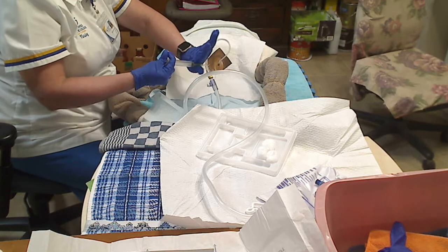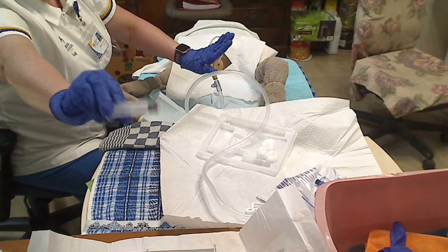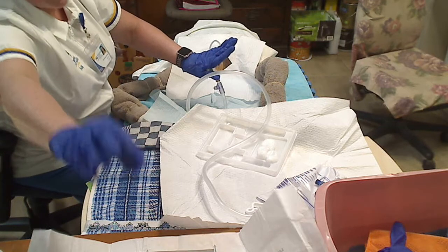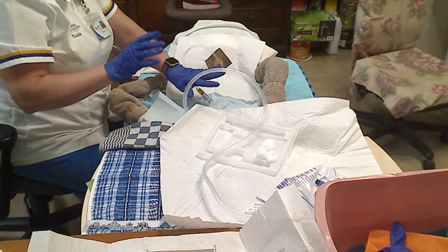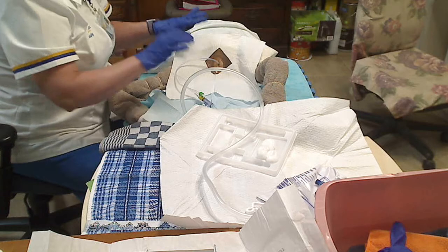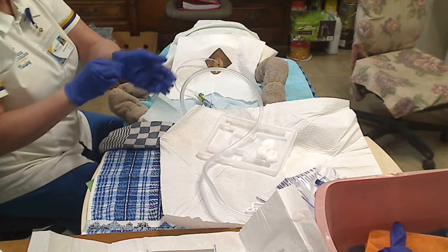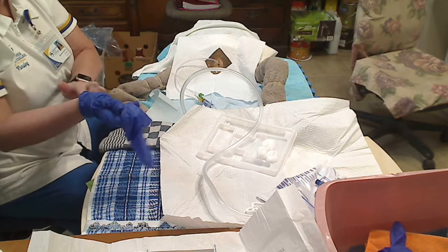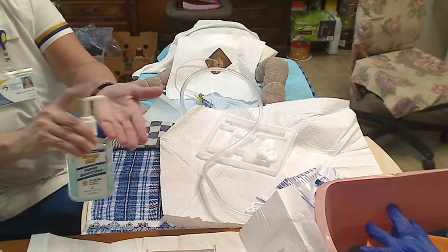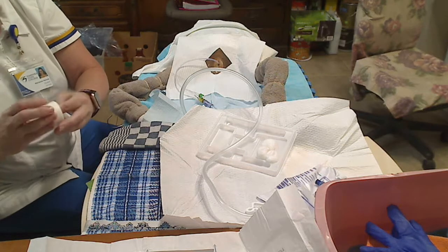I will use a clean portion of my hand. Again, I'm going to toss it to the garbage for now, but it will eventually go into the sharps because it is a sharps container item. From here, I'm going to say, Miss Anna, does everything feel okay? Yes. I'm going to, because I don't want to touch anything because my hands have been touching all of her, go ahead and remove my gloves, hand sanitize, break off a small piece of tape.